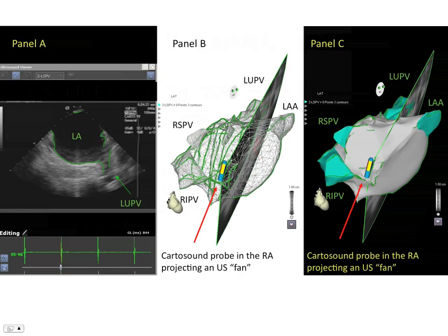This image shows image acquisition and 3D map construction using CartoSound technology. On the left, you can see a frozen intracardiac echo image. During each acquisition, 3 seconds of intracardiac echocardiography are recorded, during which one can acquire a number of gated images of the cardiac structures of interest. In this case, the left atrium was viewed into the left upper pulmonary vein.